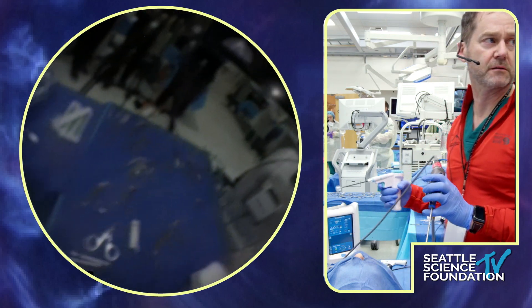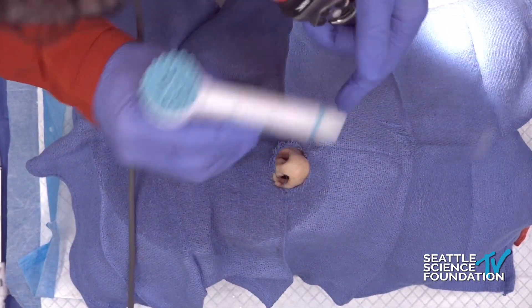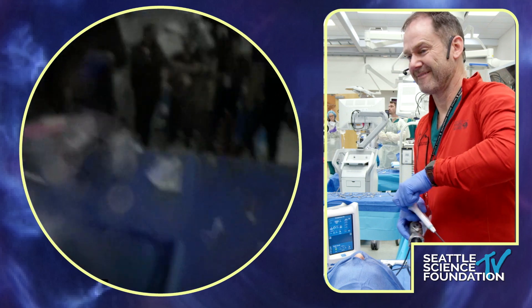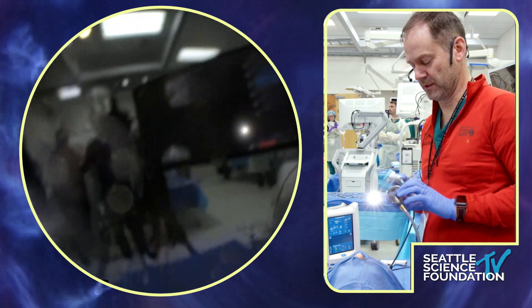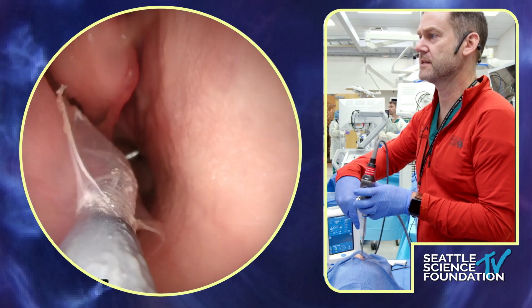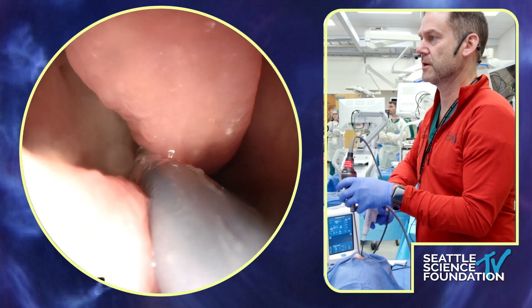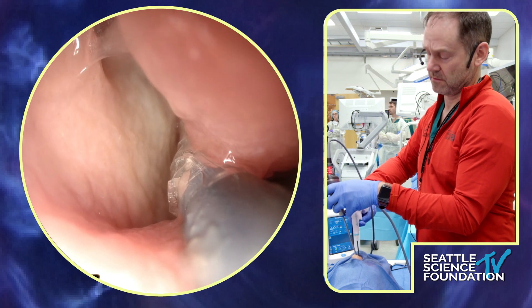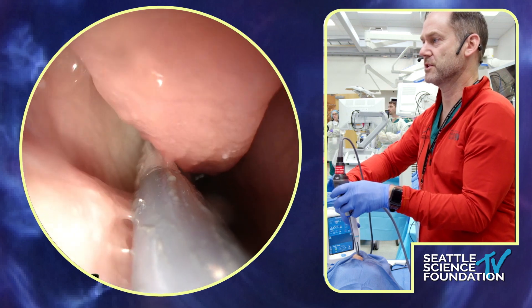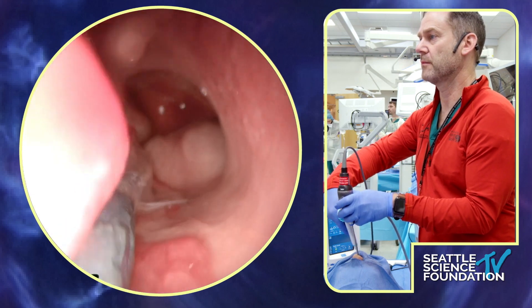If Trevor's here I can show the right side real quick too. This is the Clarifix device. Pro tip: you've got to get your workout in and tighten that down. As we go in, we're going to tuck it right underneath the attachment of the middle turbinate, pull the trigger, and if done right it will be inflating with gas and will freeze that tissue right there. Make sure you're not over the torus back there — you just want to be tucked up right in that position.